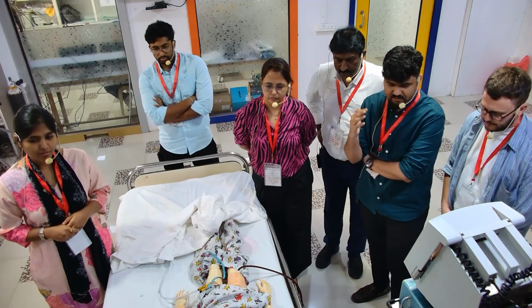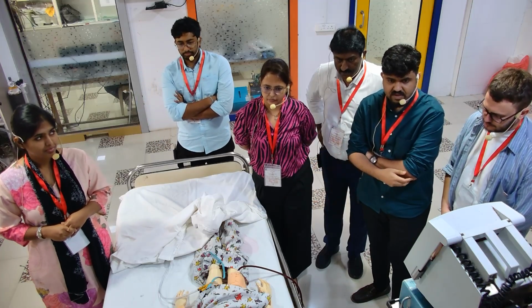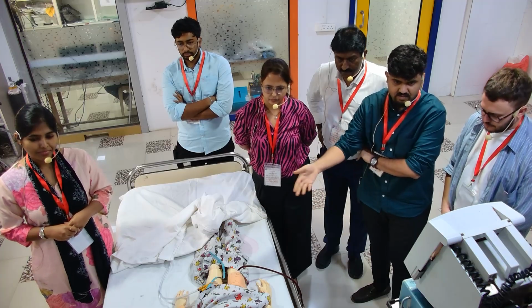It should have started from the patient end or the machine end. Ideally, patient end to the machine would have been the best approach, because the cannula site is where we start. A bit before that, you are now going in the right track.